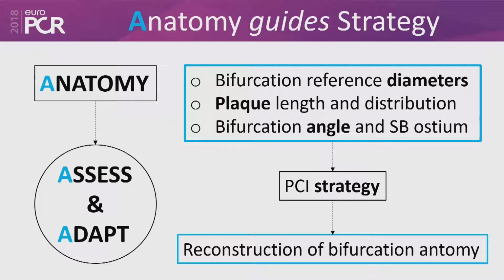That's a good question. Well, the problem was that the patient history was such that the patient had actually NSTEMI. So he was referred to our institution after 2 or 3 days of chest pain onset, and we thought that this plaque may be an unstable plaque. So after wiring the LAD, he quickly developed symptoms, which is why we chose to wire the LAD first, to secure the largest myocardial territory.